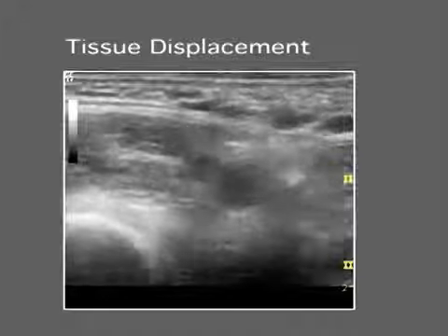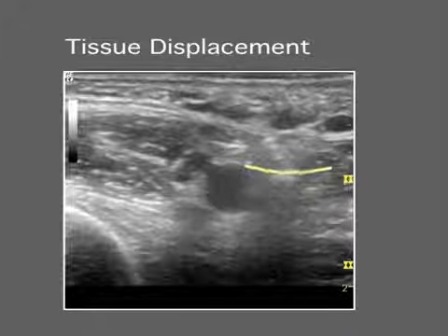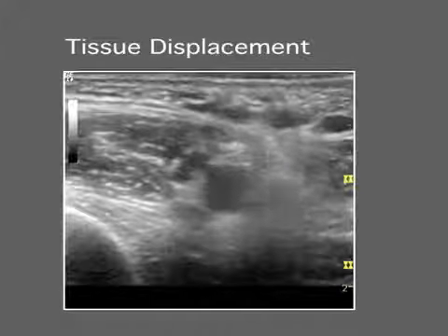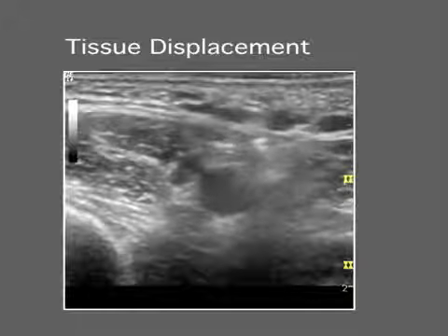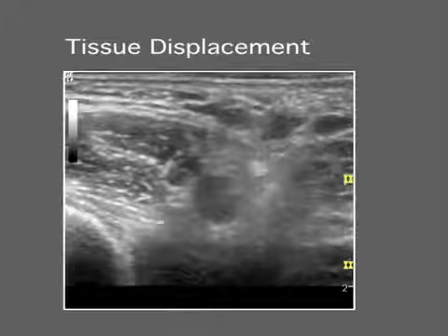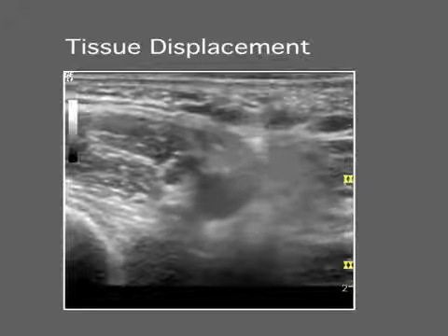Generally, tissue displacement is transmitted far enough along tissue planes for the operator to get a sense for the trajectory of the needle. This is a dynamic process and relies on the operator's ability to detect tissue displacement created by needle movement. Staccato movements should be avoided.